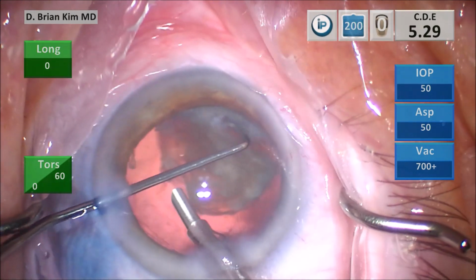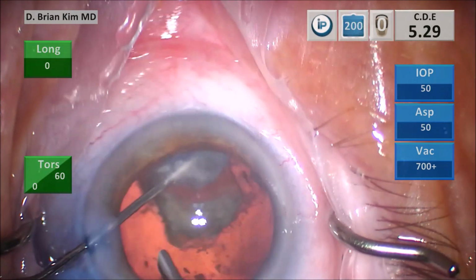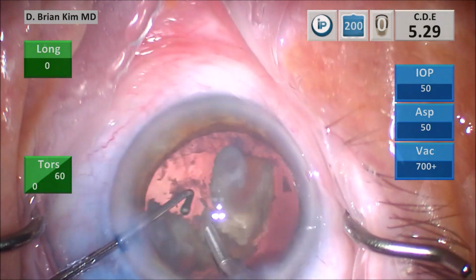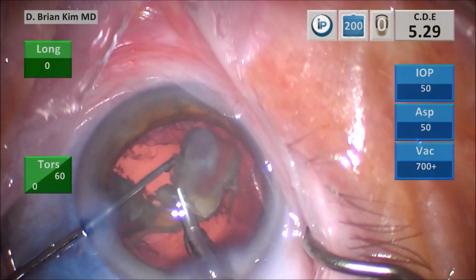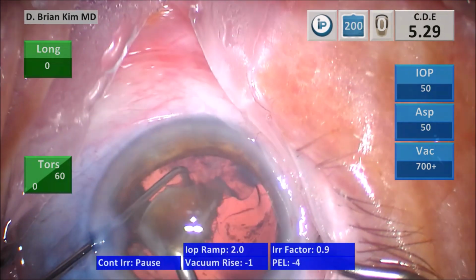But if the posterior capsule is not exposed, I like to phaco the lens pieces with a piece of lens material that's buffering between the posterior capsule. So that's what I like to do. If I'm eating pieces, I like to make sure there's a lens piece that's still within the bag to protect the posterior capsule as I eat pieces. So you saw I was able to divide that last quadrant.